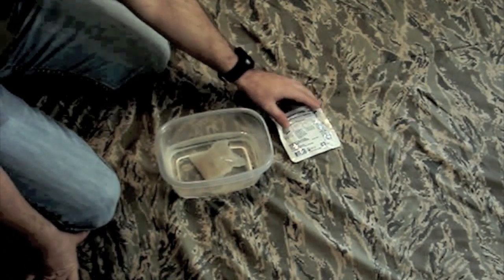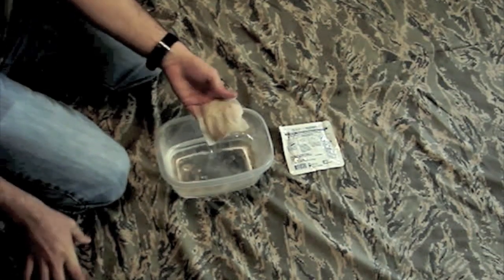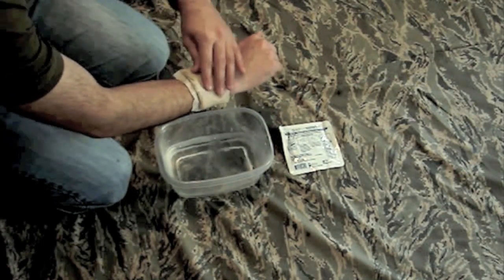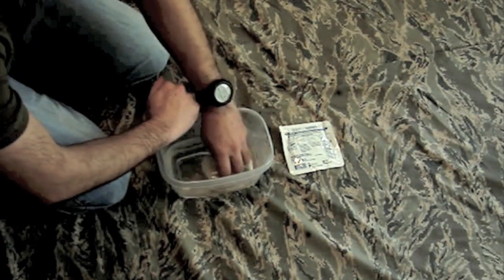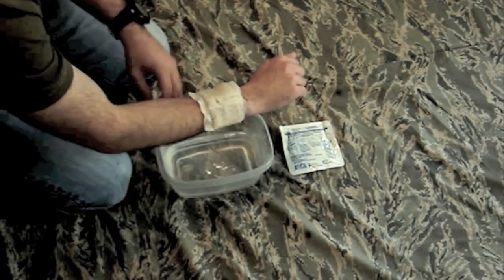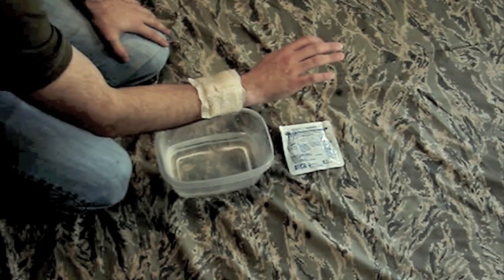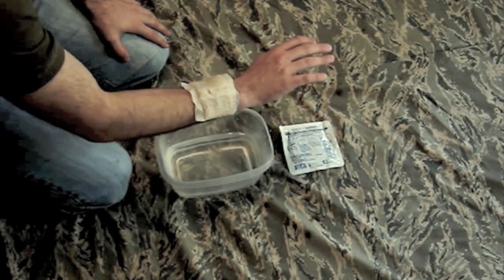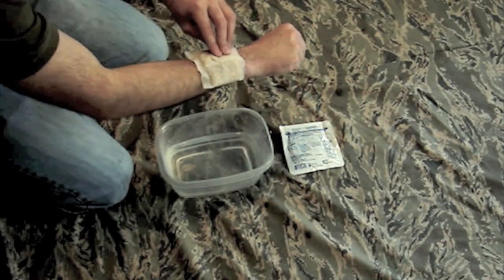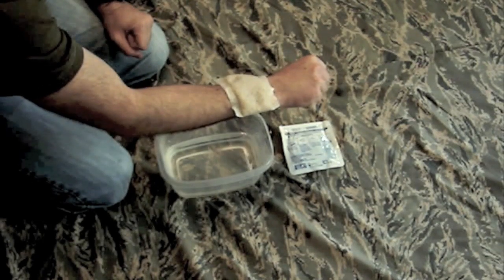Ordinarily if this was on a gunshot wound victim — it's got instructions right on the back — what you would do is take it out, put it on the wound, and wrap it up with gauze or something like that. Obviously I'm not shot, so I need to put some moisture on it and put it on my skin. Being that I'm not bleeding, I have to take QuickClot's word that it would stop the bleeding. But there's no heating up, there's no reaction — it's not burning me at all. Actually it's a little bit cooler than the water I just took it out of, so that's a good thing. As you can see, the new formula — they obviously modified it — and it's now a lot better than it was.